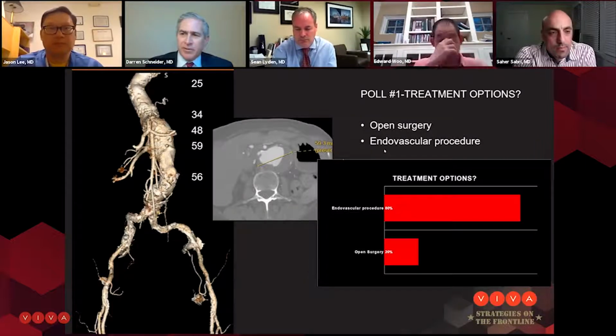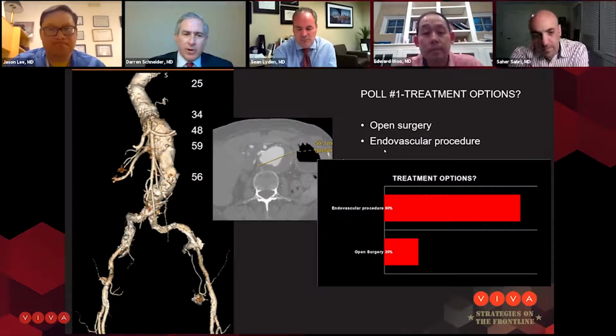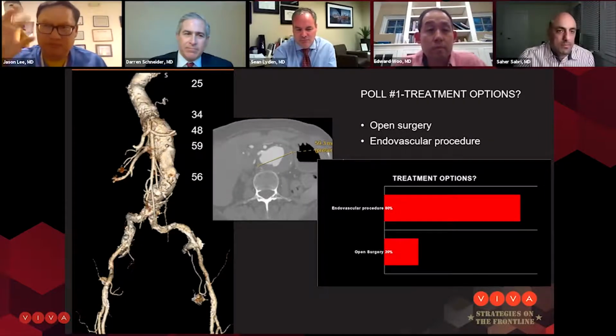Jason, what was her renal function? Did I miss that? Yeah, renal function baseline 0.7, but at her age, a GFR is about 45. And that early branch on the renal artery, how important is that? It looks fairly small to me. Yeah, it's pretty small, about 1.5 millimeters. It goes to the upper posterior part of the renal.